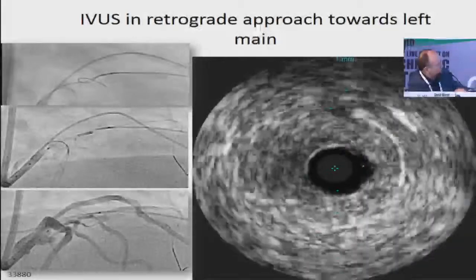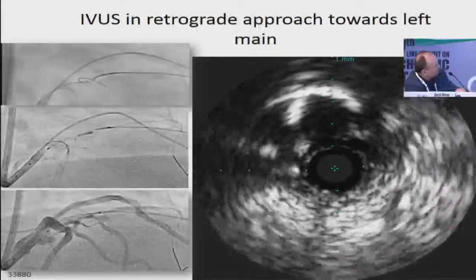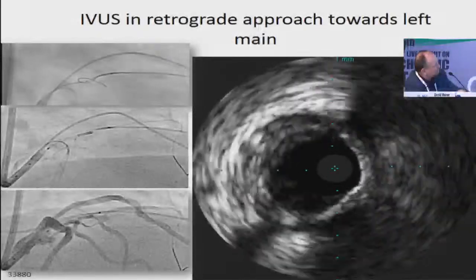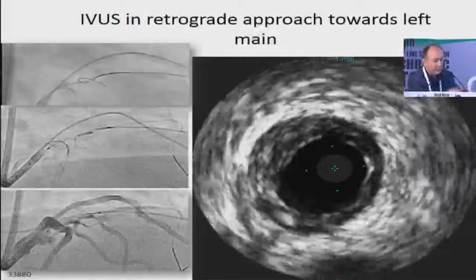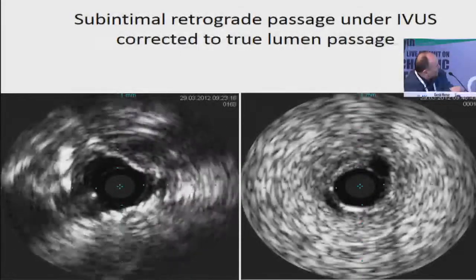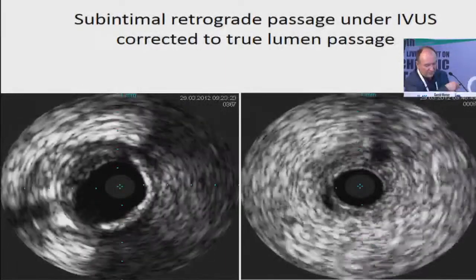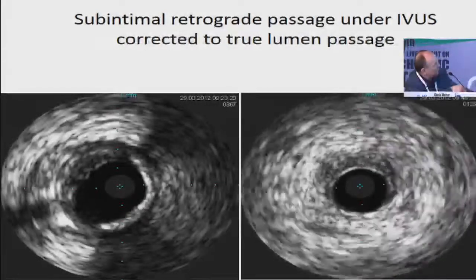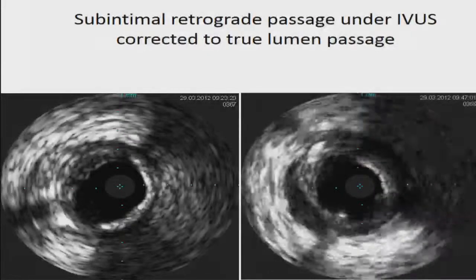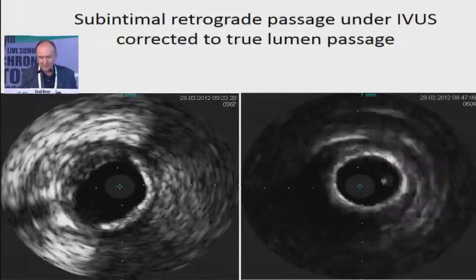Now we need to understand the IVUS imaging. This is the very small side branch. The LAD is here, and the wire is coming outside through the sub-intimal space — it looks like it's there, but it's sub-intimal. If I would progress even further, I would create great havoc in the left main. I had to reposition and rewire. The first attempt is closer, but still sub-intimal. I did another repositioning with a Confianza wire, and now it's clearly straight through the true lumen into the LAD. There's some sub-intimal hematoma already created, but we are in the true lumen and we can conclude this case.